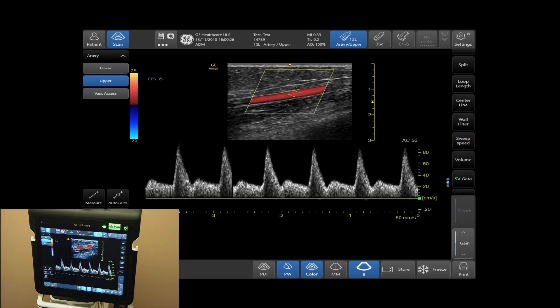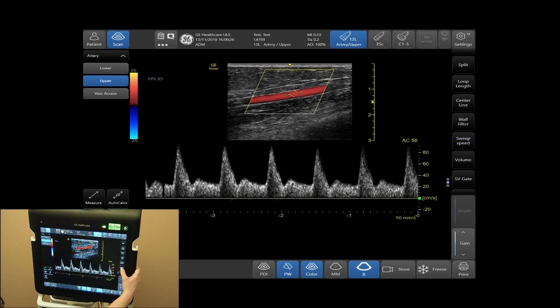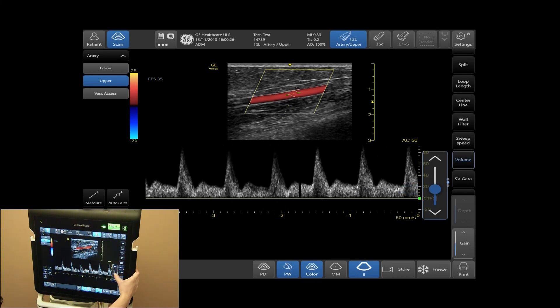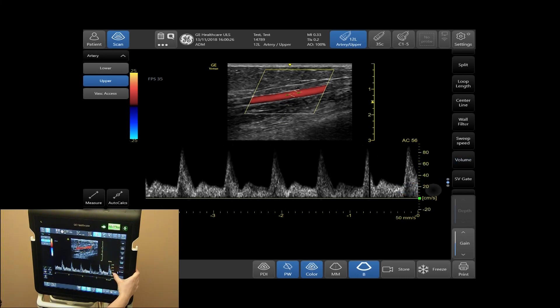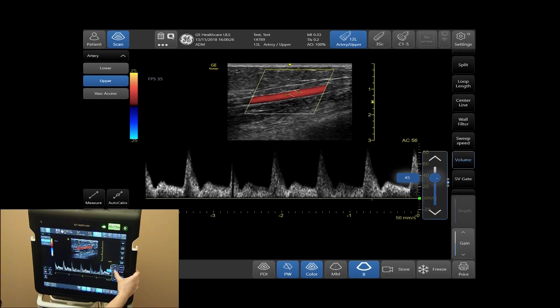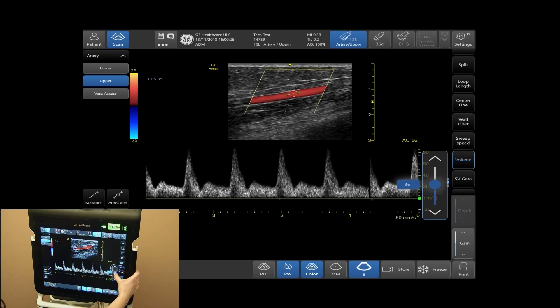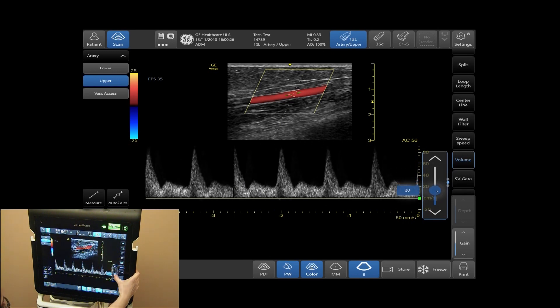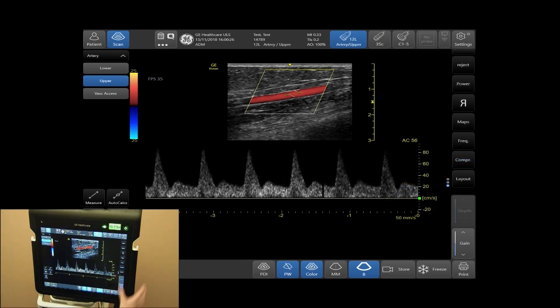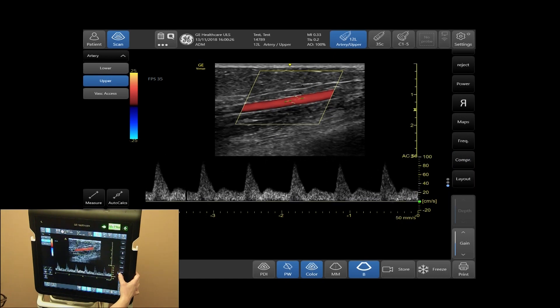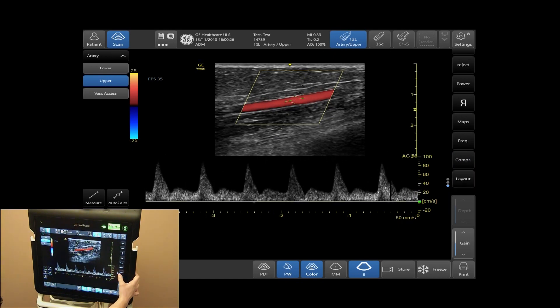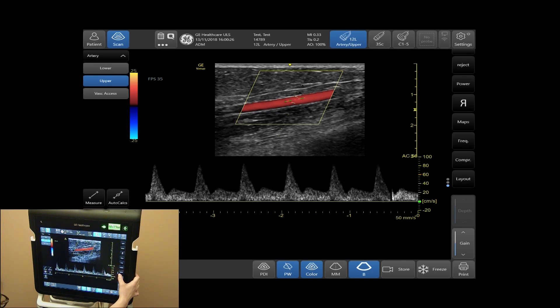To adjust your volume, tap Volume. This will increase and decrease your Doppler signal sound. By selecting Layout, you can adjust the horizontal border between your B Mode and Pulse Wave Mode, making your B Mode and Timeline image larger or smaller.